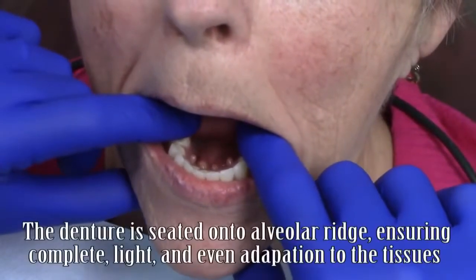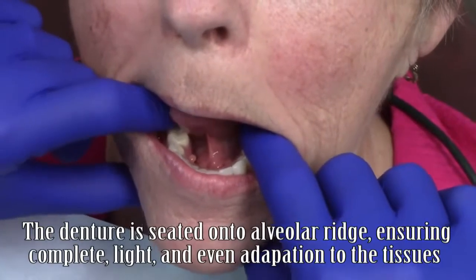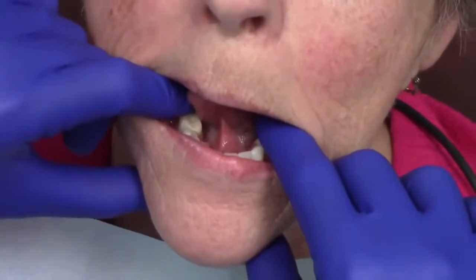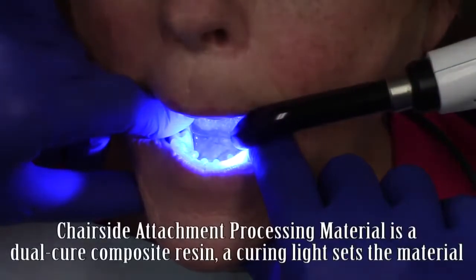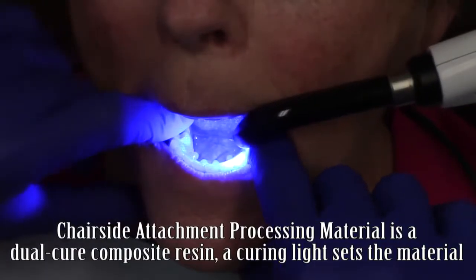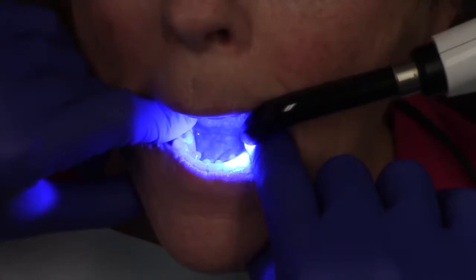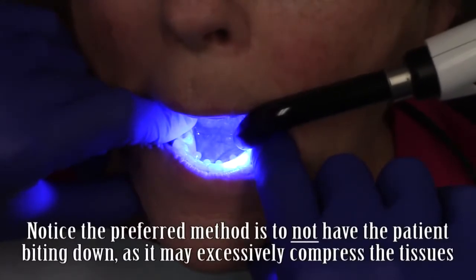Using gentle finger pressure, I'm going to seat the denture onto the ridge, ensuring that I have adequate flow of the chairside attachment processing material out the lingual vent holes. It's important to understand that I use finger pressure only and no biting forces during this procedure to ensure complete tissue adaptation of the denture during the attachment processing phase of this pickup procedure.